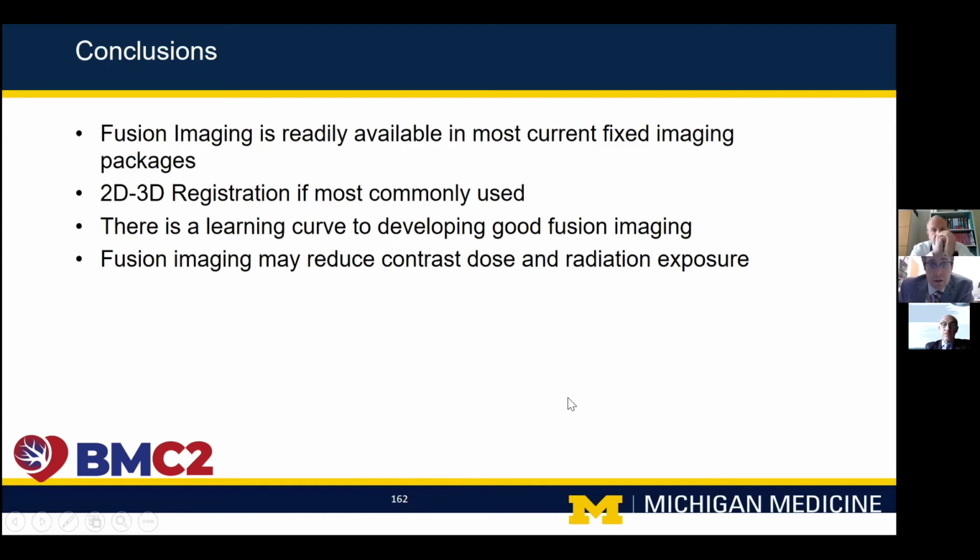So, question about using IVUS in conjunction with the image fusion. I have used IVUS, mostly in the thoracic aorta, not so much in the visceral aorta, but I think it's a good adjunct as well. You could easily use it to mark your visceral segment and not use any injections, and I think that'd be fine as well. I am probably a little more impatient, so I just do a quick puff instead of using IVUS, because it's pretty quick, and 7 cc's of contrast isn't very much.